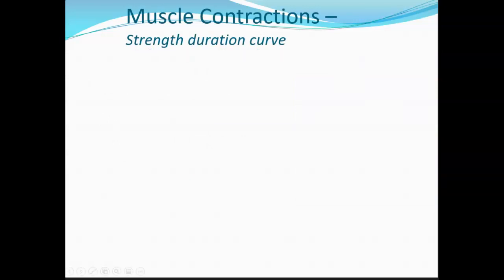This is where I do want to spend time, and this can be confusing. So heads up, but I'm going to try to make it as little confusing as I can, pretty reasonable. This information starts on page 247. Actually, the section starts at the end of 246, but then it starts talking about the stimulation levels. That's what the strength duration curve is used for, to compare different types of neurons and how much the stimulation has to be to depolarize those.